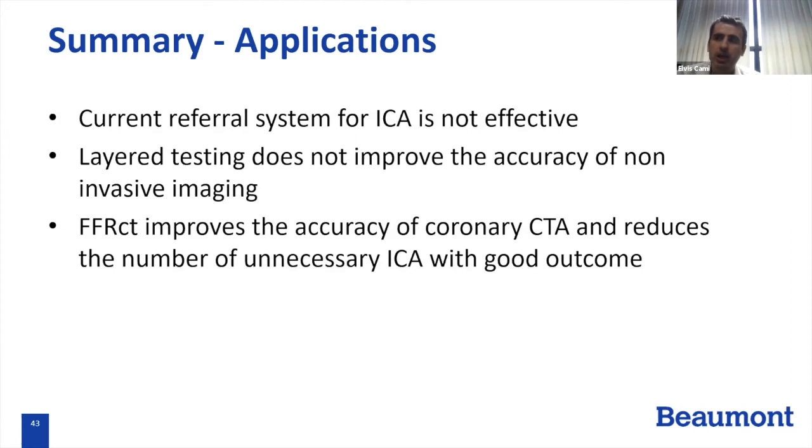Up until about a year ago, we had a policy of the maximum dose the patients can get is 200, so if we needed to repeat it, we had to stay within that 200. Radiology changed that policy about 6 months ago, so now that maximum dose is like 250. So if we need to repeat it, essentially it'll be about the same.